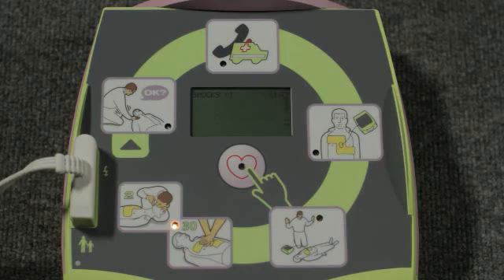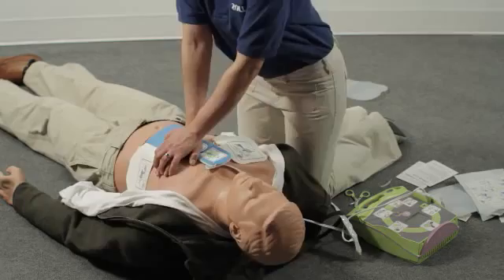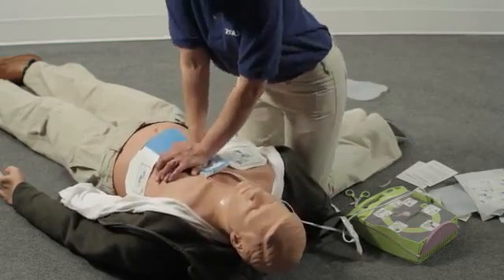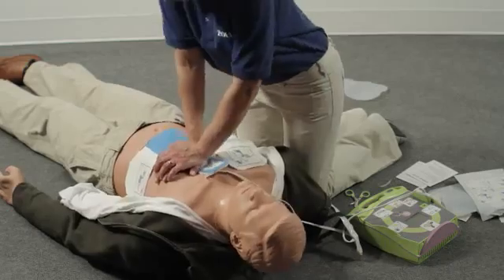After giving 30 compressions, you should give 2 rescue breaths. Repeat this cycle of 30 compressions followed by 2 rescue breaths until the AED Plus tells you to stop CPR. Rescuers who lack the training or confidence to perform rescue breathing should perform continuous compressions without stopping.